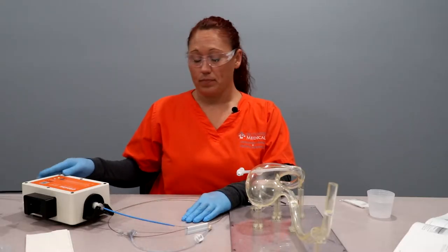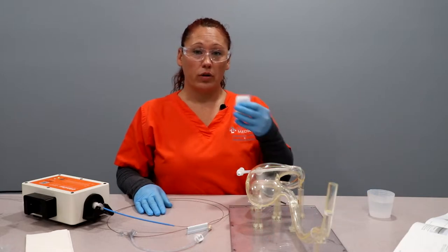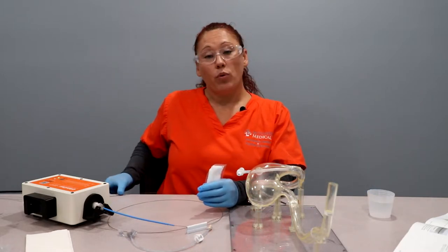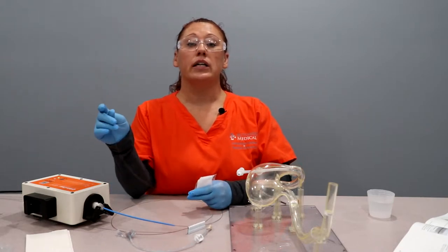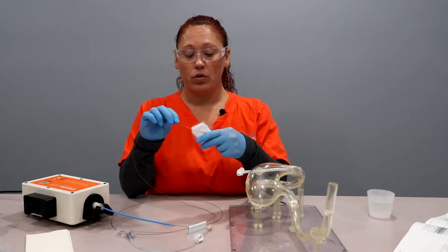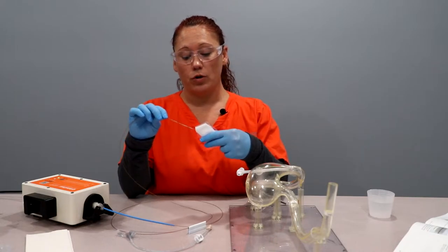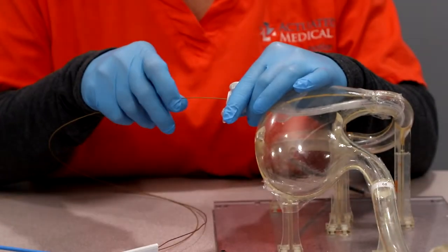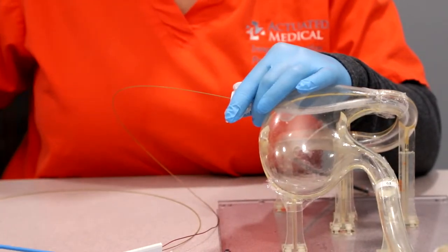First, we want to open our coconut oil. It is very important to frequently and always coat the GJ Clearing Stem with the coconut oil. Every time you remove it from the tube, you are going to re-coat. I'm going to place it in the J port and then turn on the control box.